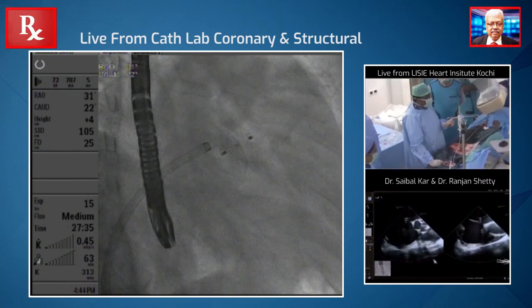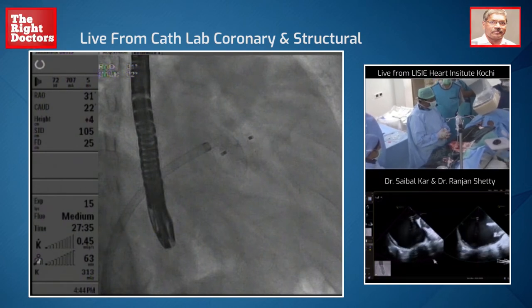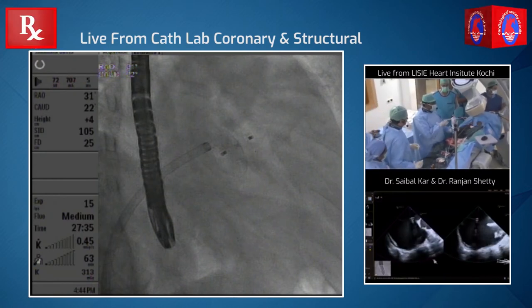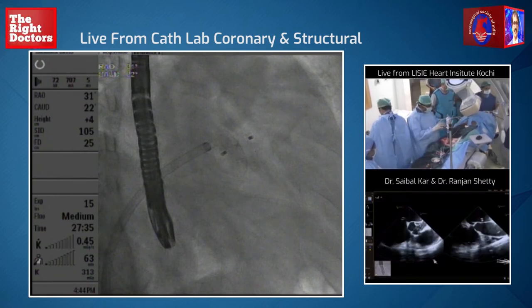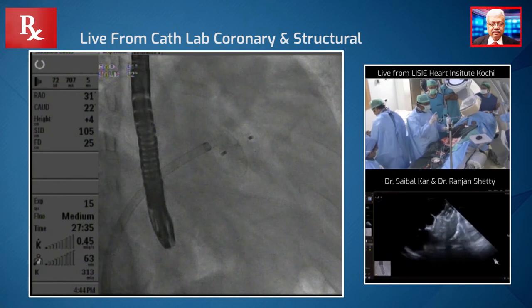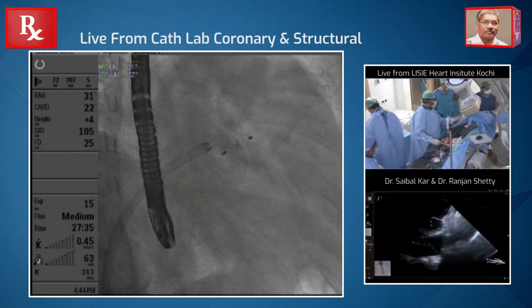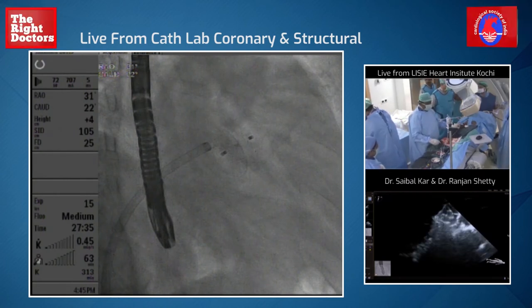The entry point of the LAA? No — it's actually the landing zone. We measure it at the junction of the trabecular part and the smooth part at the level of the circumflex artery. Edwin, can you show a pre-picture? That is the landing zone — it's called the landing zone. We're going to show you an image so that you can see it. Show the pre images — I want to show a pre measurement. We're going to show you where it's done.